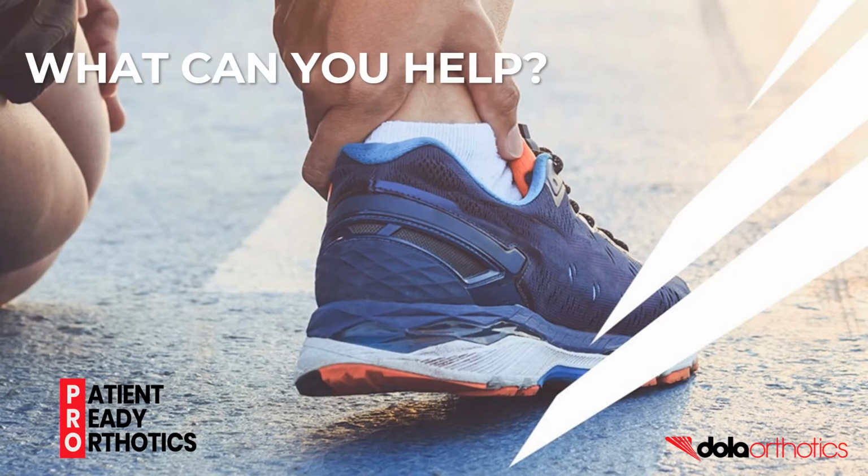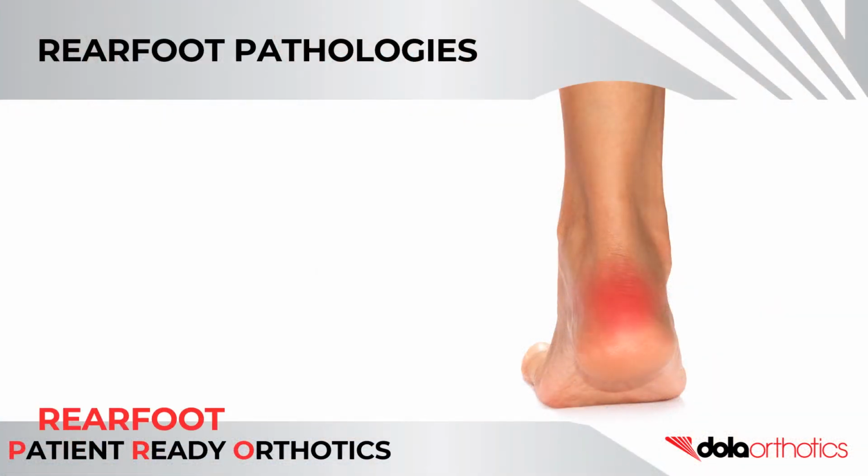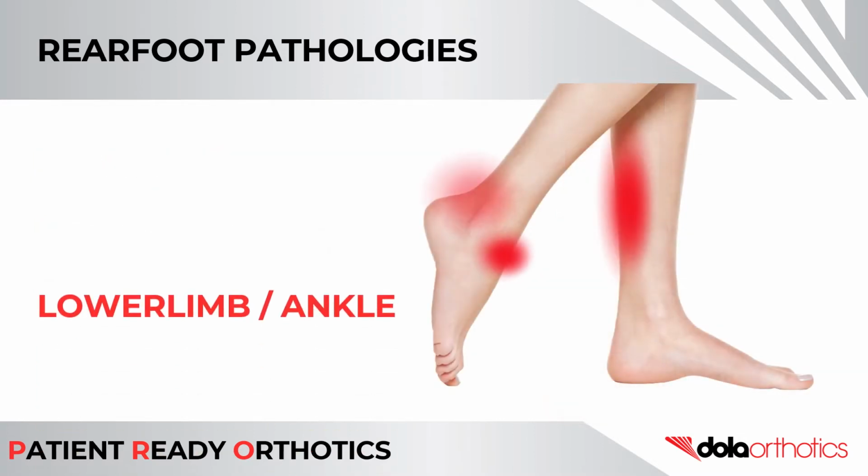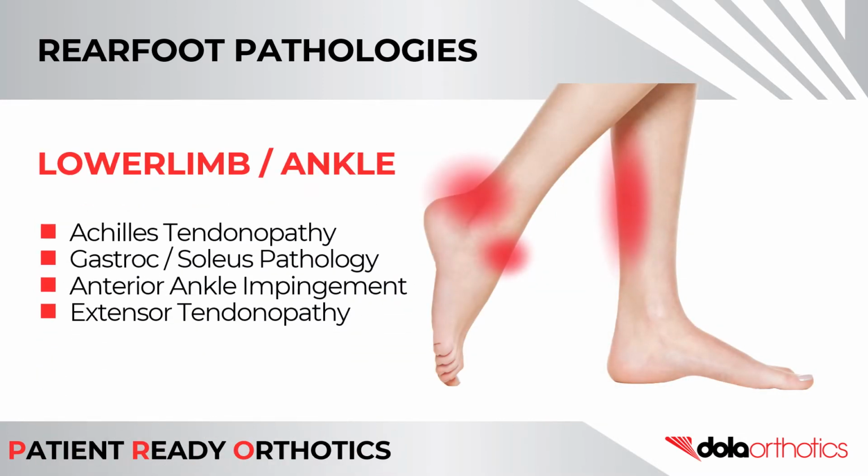Your patient may present with pathologies of the rear foot or posterior leg from an injury, overuse, or related to a disease process. These include common rear foot pathologies: Severs or Calcaneal Apophysitis, otherwise known as kids' heel pain; Retrocalcaneal Bursitis or Haglund's deformities; and lower limb and ankle pathologies, including Achilles tendinopathies, Gastroc and Soleus pathologies, anterior ankle impingement, or extensor tendinopathy.